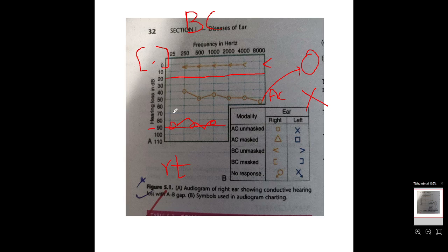If the graph is made here, it means the person is hearing at 70 decibel, which is not normal. It should be up here, not very far below the 20 decibel. I hope you got my point.